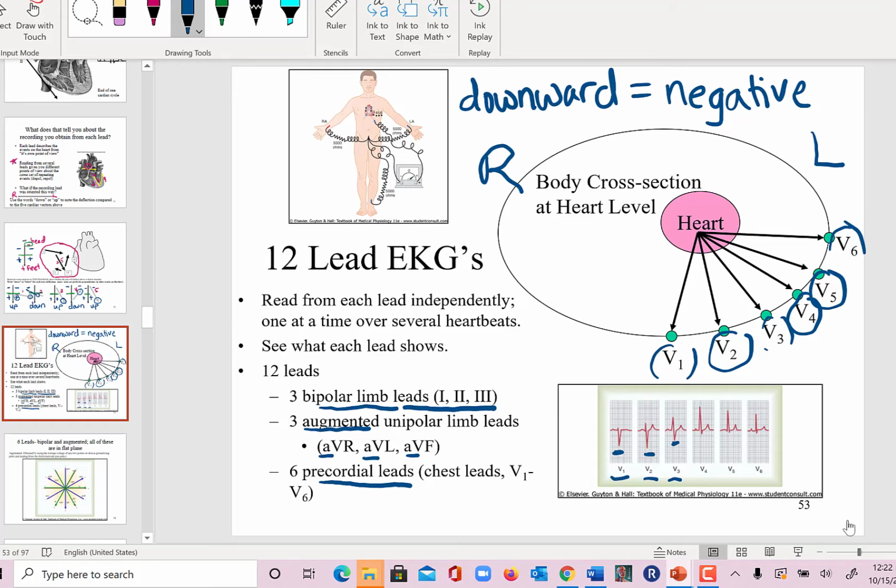Remember, most of your cardiac vectors are pointing down and to the left. That explains why V1, V2, and V3, if you look carefully at the pictures down here, have a downward deflection. That means negative deflection, going below baseline, anti-parallel. V1, V2, V3 are pointing over towards your right arm, anteriorly over towards your right, so across your chest to the right. They are anti-parallel to most of the cardiac vectors, which point down and to the left.